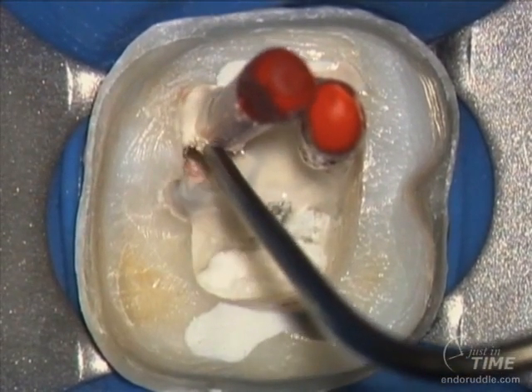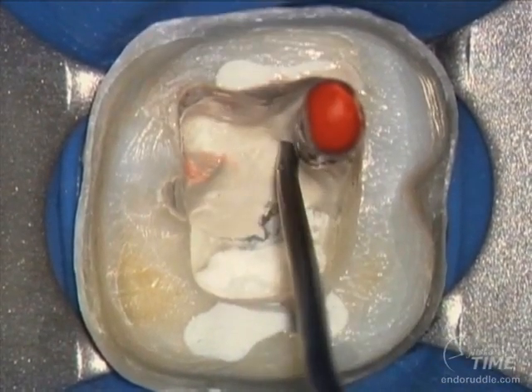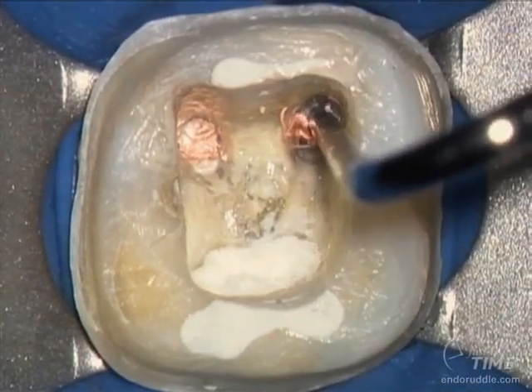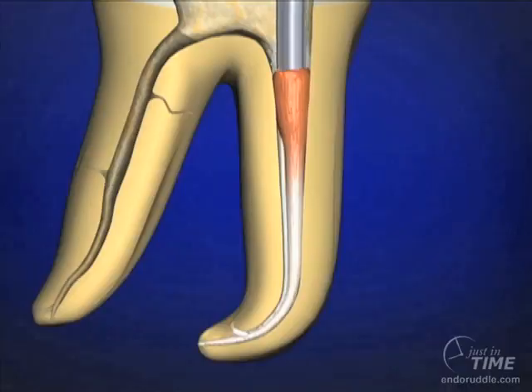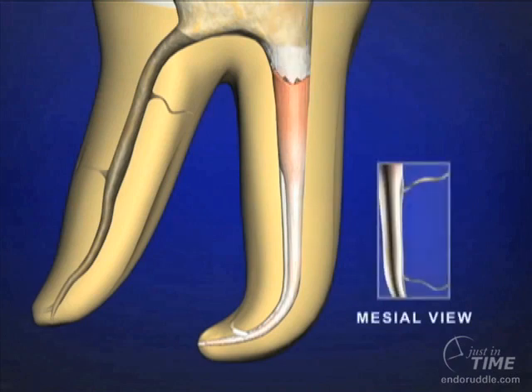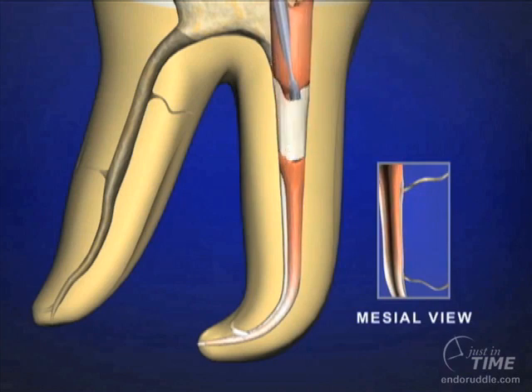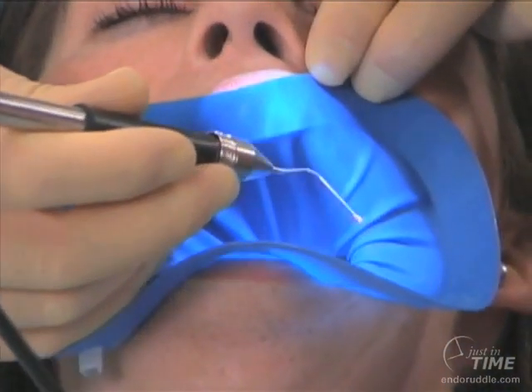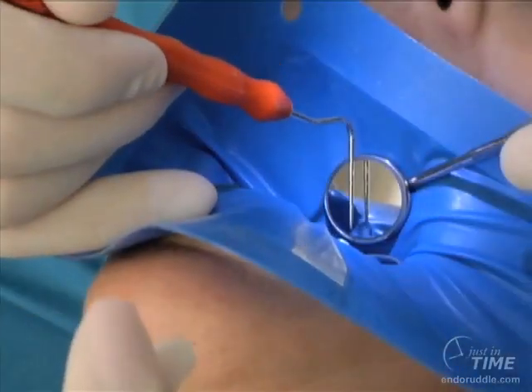Here is the electric heat plugger searing off the non-useful butt of the cone. The heat wave is about 5 millimeters, and thermally softened gutta percha has compaction potential. Step the plugger around the walls — as we press, the cone is being deformed laterally and vertically over a few millimeters. Come in cold, activate the electric heat plugger, and plunge about 3 to 4 millimeters. By removing the instrument, you remove a thermally softened bite of gutta percha, and again, thermally softened gutta percha has compaction potential.